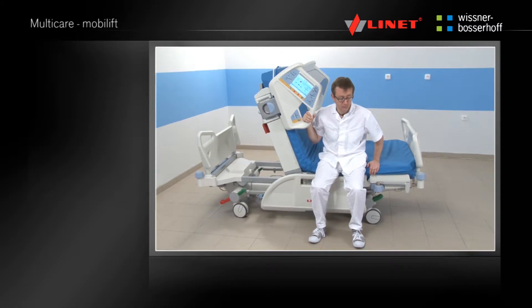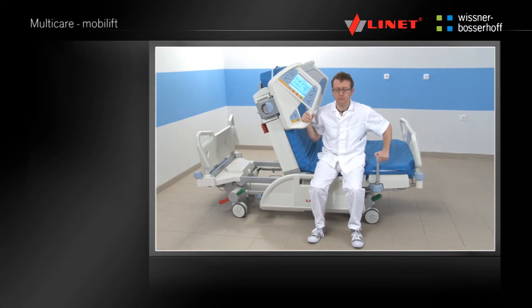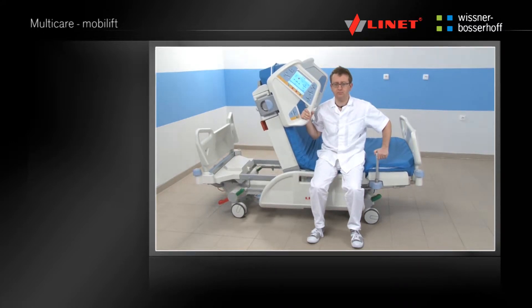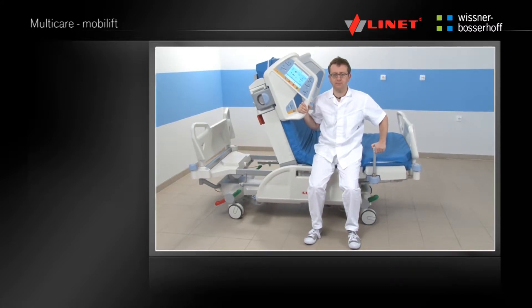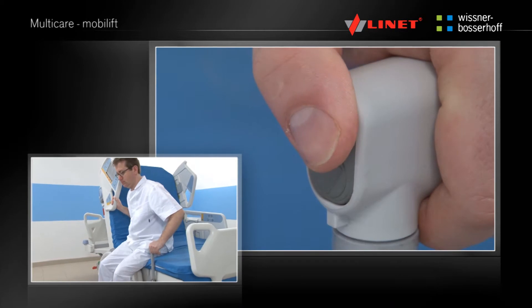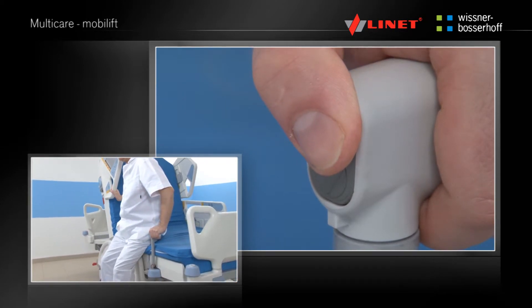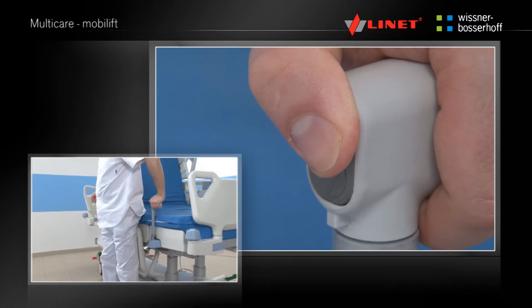The MobiLift is located on both sides of the bed, between the thighrest and calfrest of the mattress platform. To use the MobiLift, simply pull it out of the bed, lift it up and push down until it's firmly located. The MobiLift is a mobilization handle with an integrated height adjustment. Before using any function, press the Activation Go button.